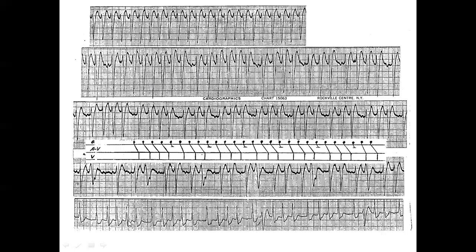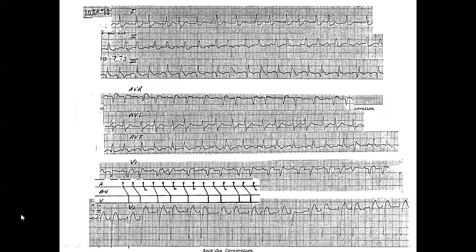And later it became like that. In V1, you can see the atrial activities here. Promptly, delay, blocked. Promptly, delay, blocked. Promptly, blocked. Promptly, delay, blocked.